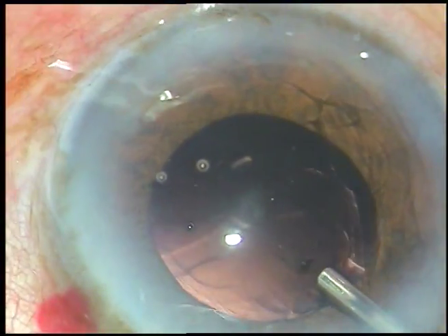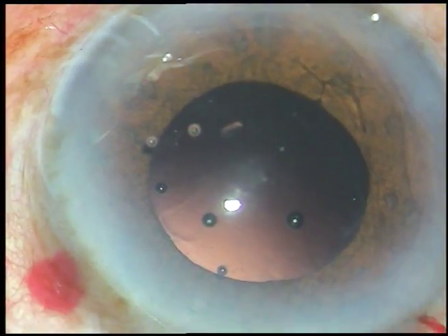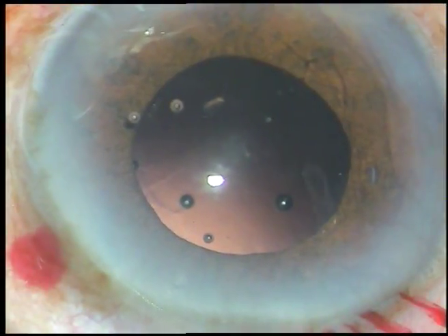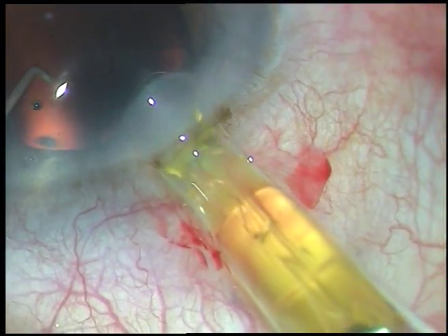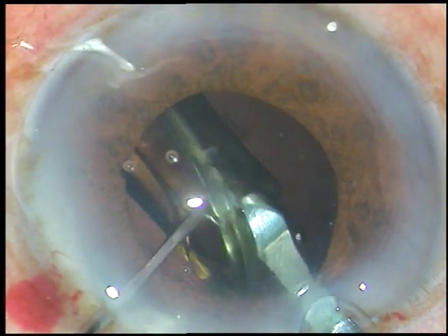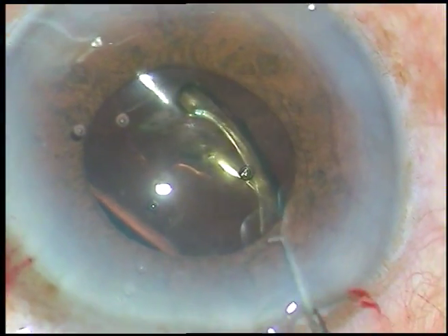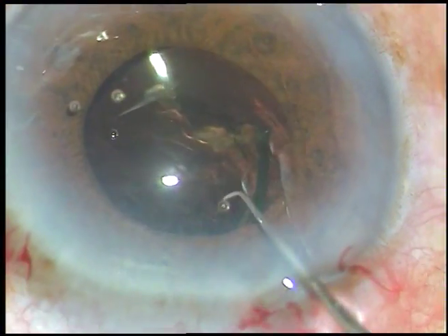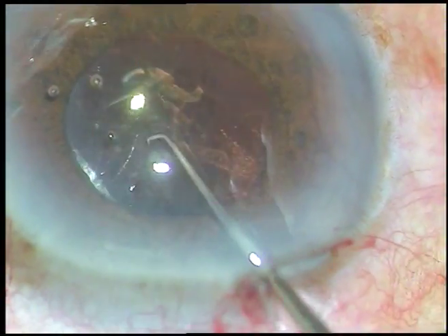I am injecting viscoelastic substance. The pupil has become again about 4.5 mm. This is a hydrophobic acrylic intraocular lens; it has gone through a 2.8 mm incision. Now the lens is dialed and the haptics go into the capsular bag, taking shelter at the equatorial region of the capsular bag. It is nicely done.